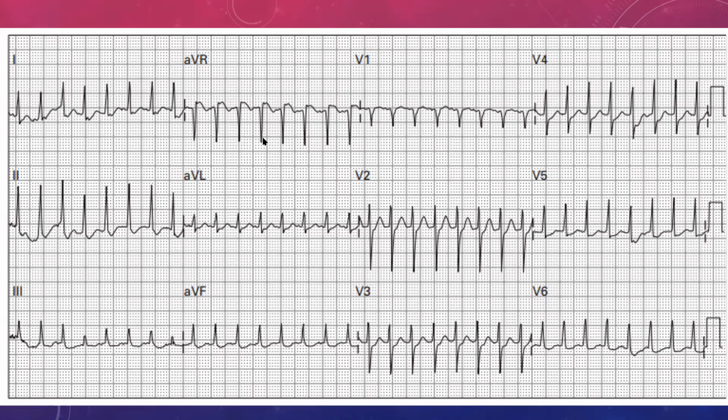It doesn't change. In fact, if you put your patient on your SATS monitor or your ECG monitor, you'll find that if it's 164, it's 164. It doesn't change. And if you've been with patients, you'll notice, even if you've got a tachycardia of 140, it's 143, 139, 141, 142. It keeps on changing. But with supraventricular tachycardias, it's like military regularity. It just carries on like that.